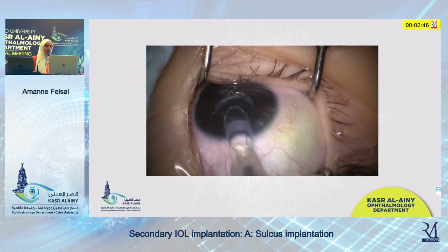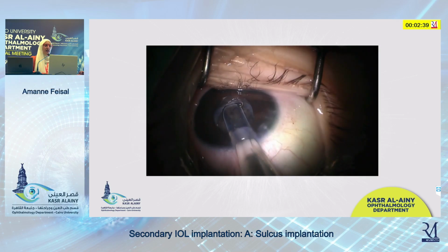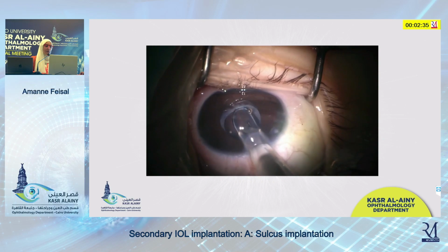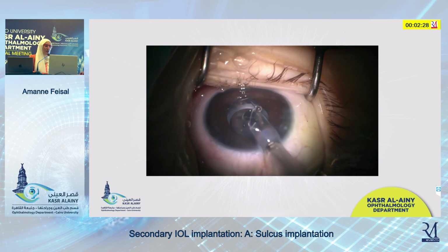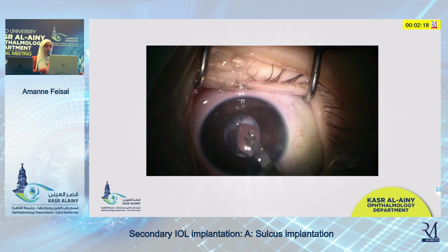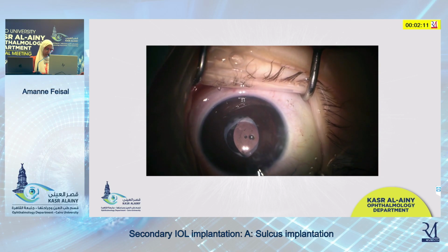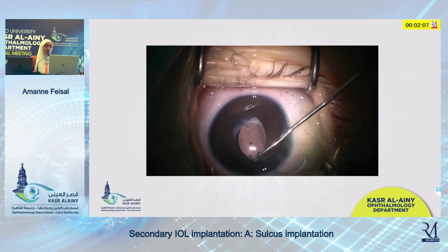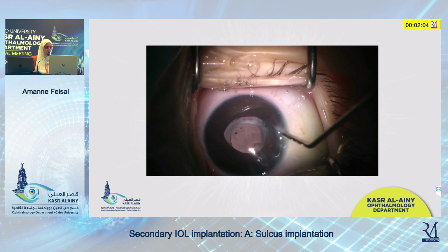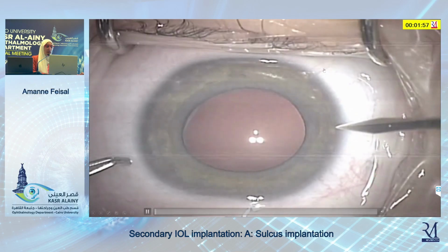And then, as she introduces the IOL, she will introduce her leading haptic directly into the sulcus. And as the IOL goes into the sulcus, the haptic going into the sulcus, the optic is being delivered, and then she will simply dial this IOL with the trailing haptic into the sulcus, and you have a nicely round pupil. At the end, remember to close your incisions, because especially when the children are young, you will have to close all your incisions.